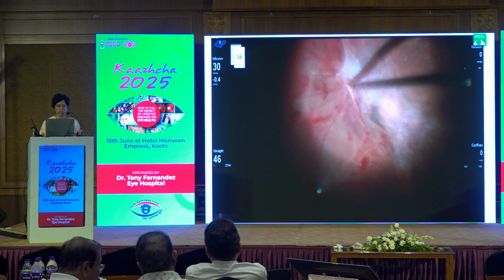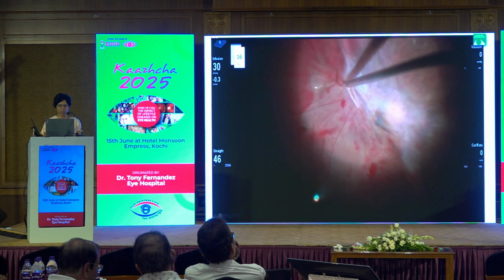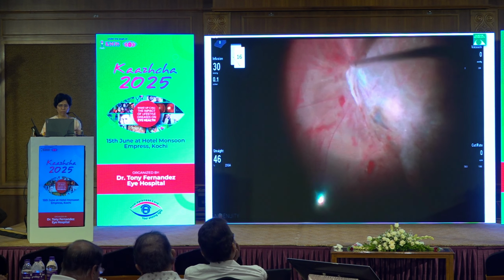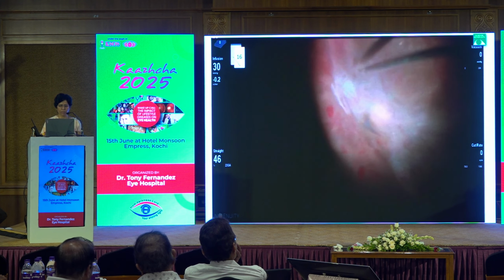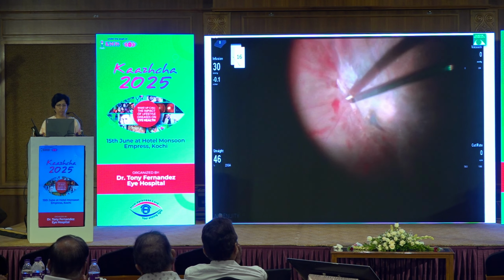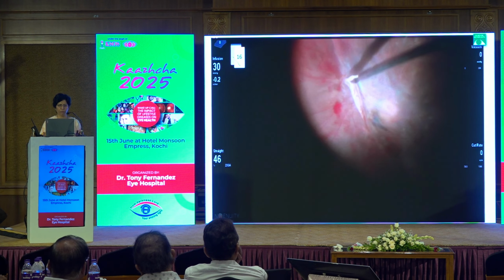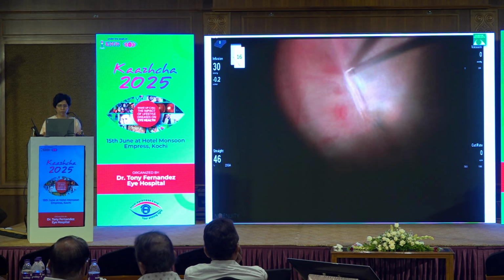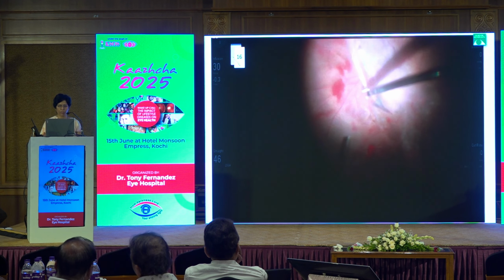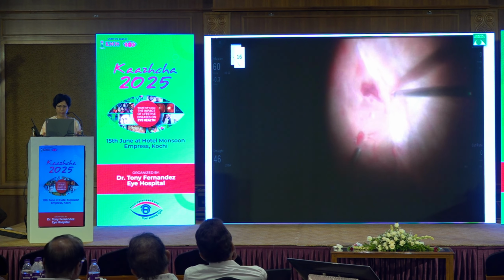You may have to search at 2-3 places to exactly locate this membrane, but once you locate it, it will help you. And so this is now the correct plane of cleavage. I hope you have understood the plane of cleavage. In this plane, you can see the surgery can go very atraumatic. You need not have any bleeding, you need not have any break, and sometimes the membrane can roll very easily. So I almost always insist to all the fellows that they must try and identify this plane for proper dissection.